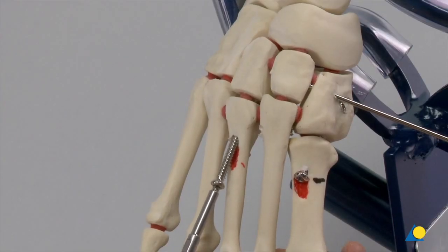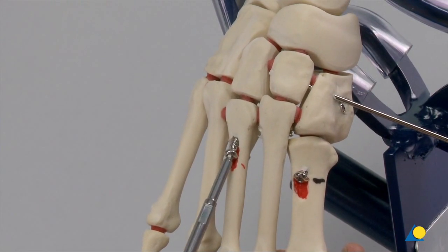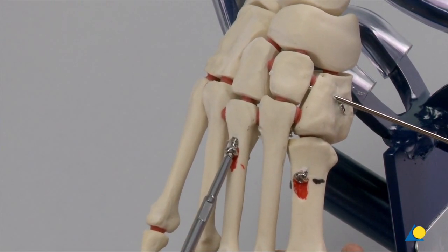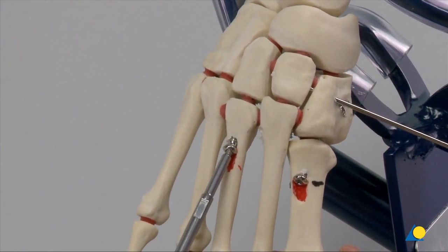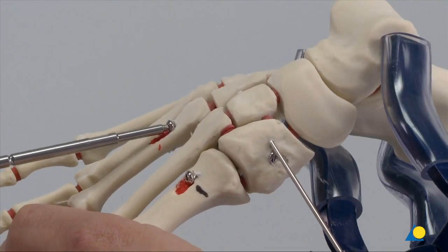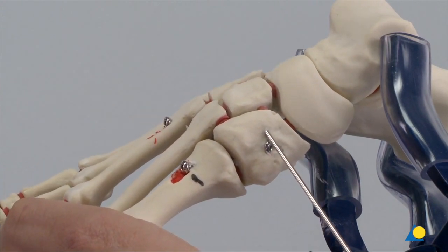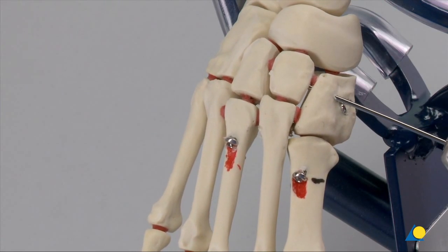These screws have been inserted as lag screws because with these non-essential joints, stiffening or even auto-fusing is acceptable as motion need not be maintained, especially in a post-traumatic injury. In many instances, fusion can actually be desirable. The remaining K-wire is removed.